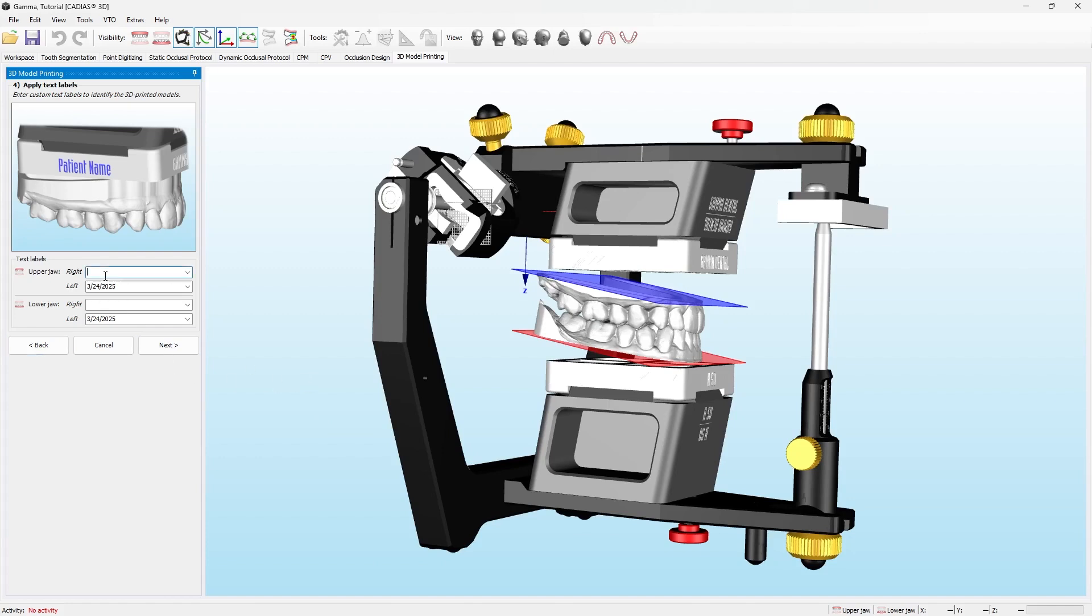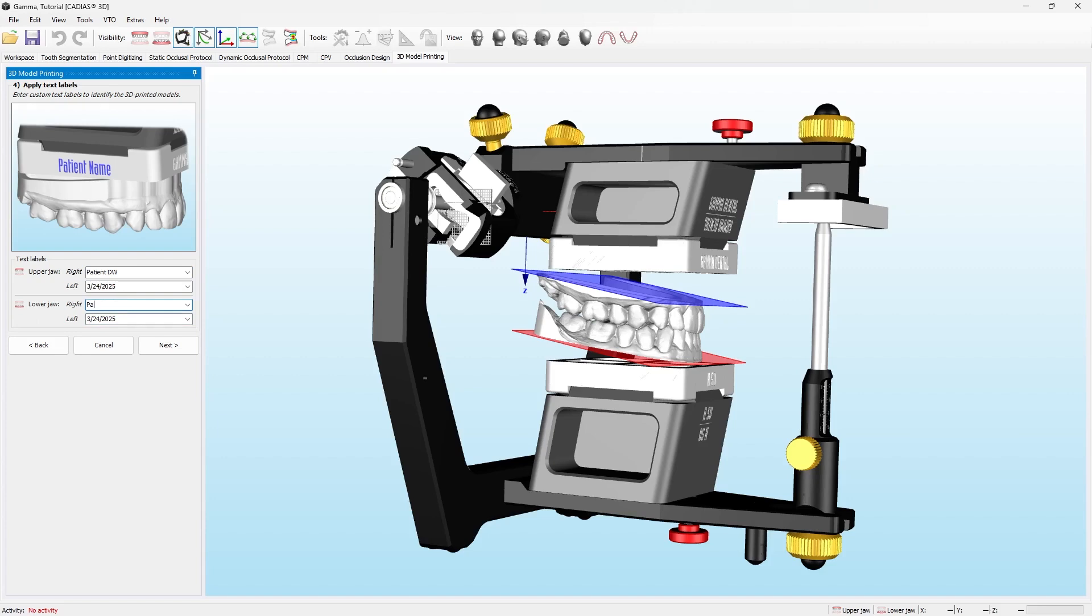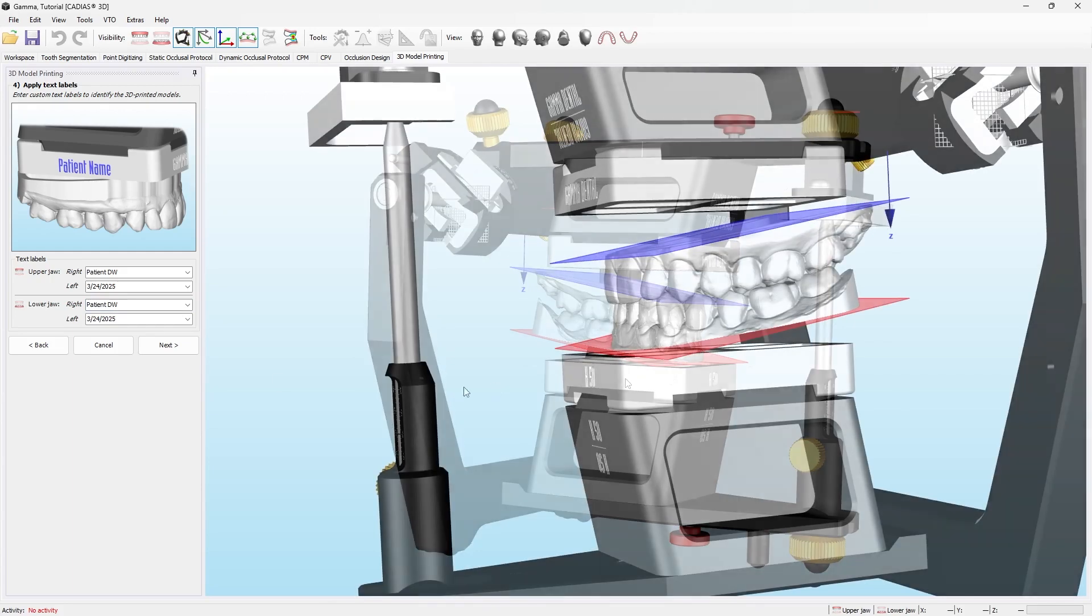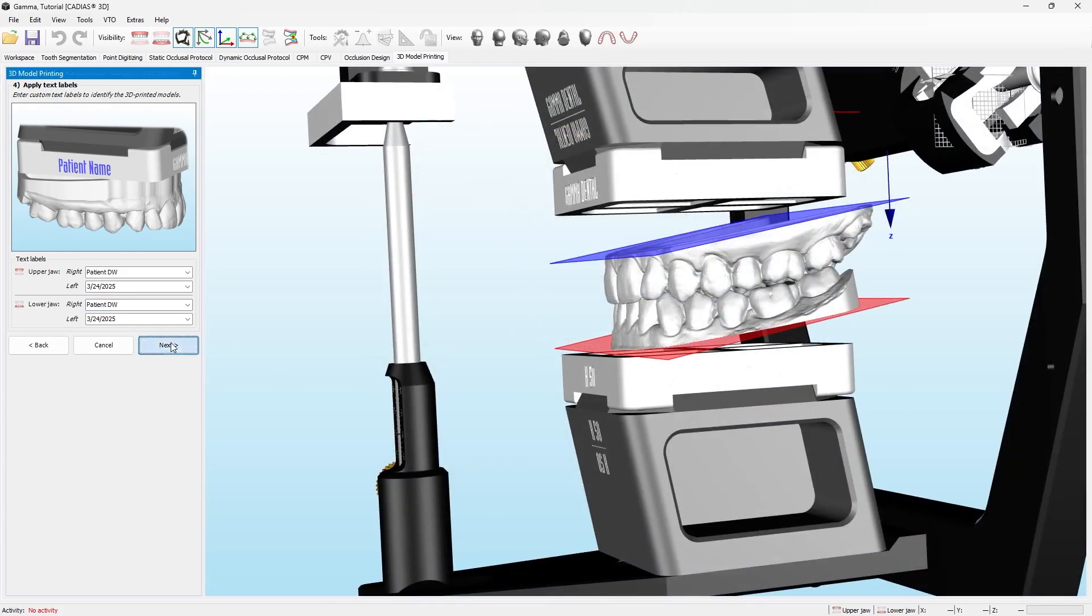The next step allows you to write the patient's name and date of the appointment on the baseplate. Press next to extend the model to the baseplate.